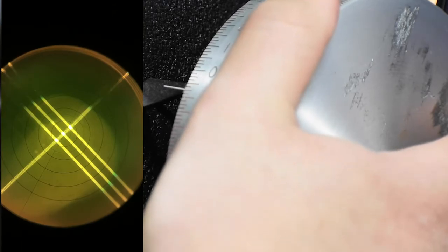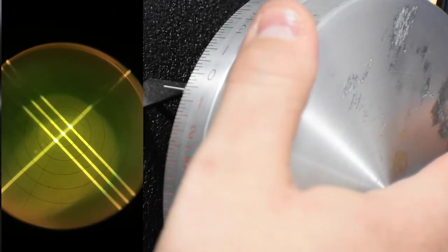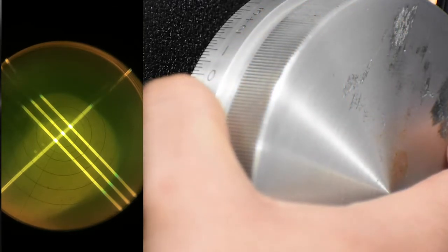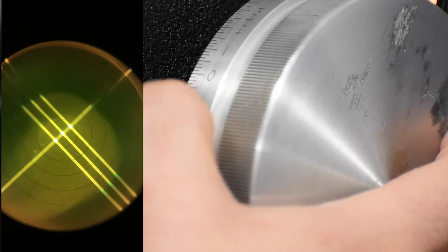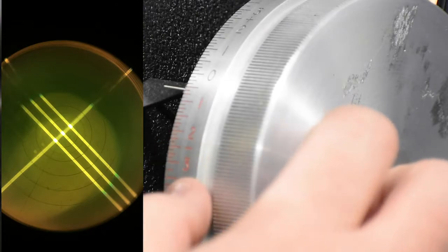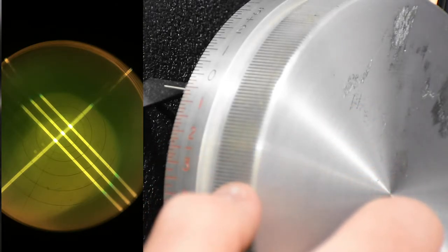And it looks like it sharpens up right about there. Yeah, so that will give us, it's close enough to a .50. So we actually moved from a -1 to a -.50. So now that is your cylinder power, and you move in the plus direction, so that's your actual final cylinder power. So this prescription is a -1 plus .50 at 165 is the axis.